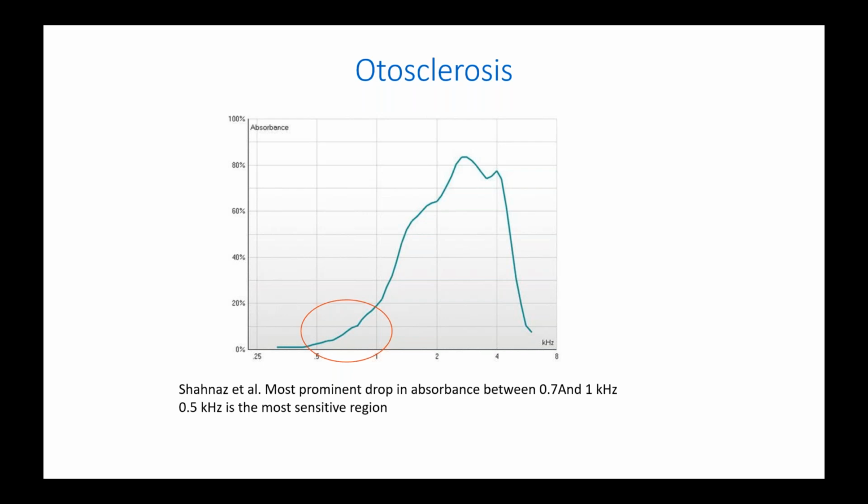For example, newborn hearing screening uses ABR technology. You don't interpret, it says pass or refer. So it is already there in some state. But for our generation, it will be exciting. We will pass out by the time it comes. No, but even in infant screening, I always say buy an instrument in which you can see the graph, plus it says pass or refer, so we can make sure whether what the instrument is saying is correct or not. Because we do know the problems there were with Algo 1 initially.